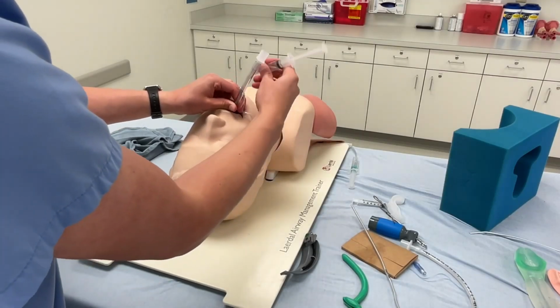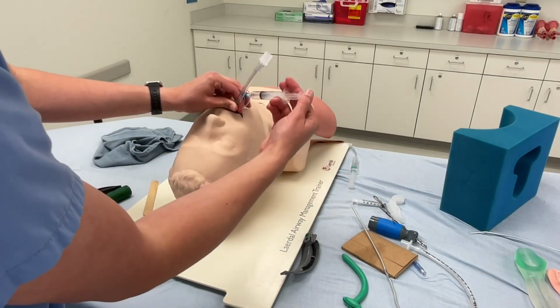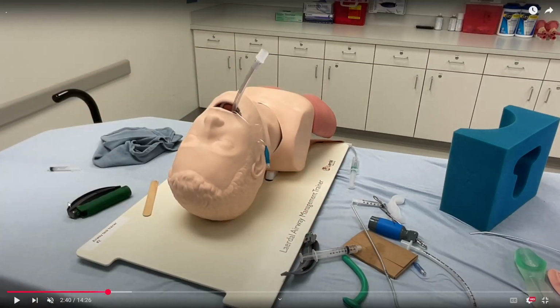Inflating the tracheal cuff. The goal is a soft bounce. You can see me check it right there. Disconnect. And then now you would hook it up to the machine or to the ambu bag and check for ventilation. You can also listen for bilateral breath sounds and to rule out gastric intubation, otherwise known as goosing the patient.